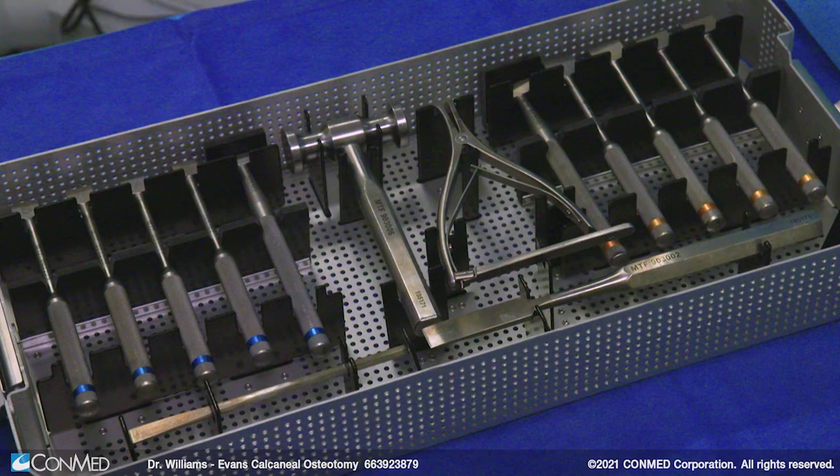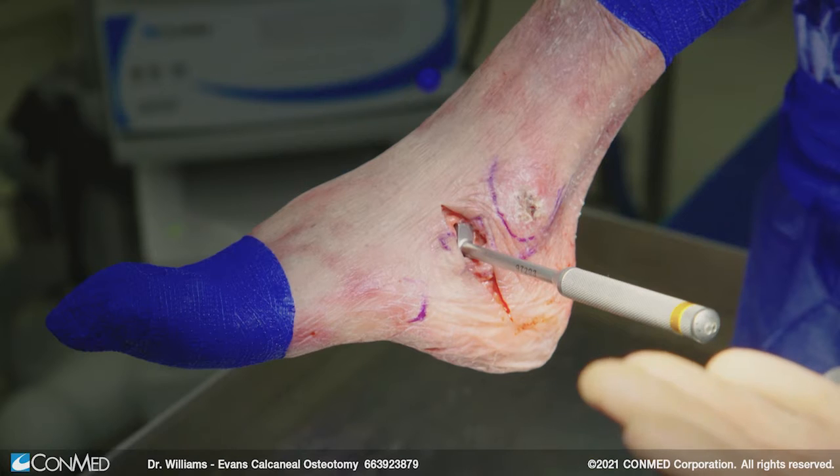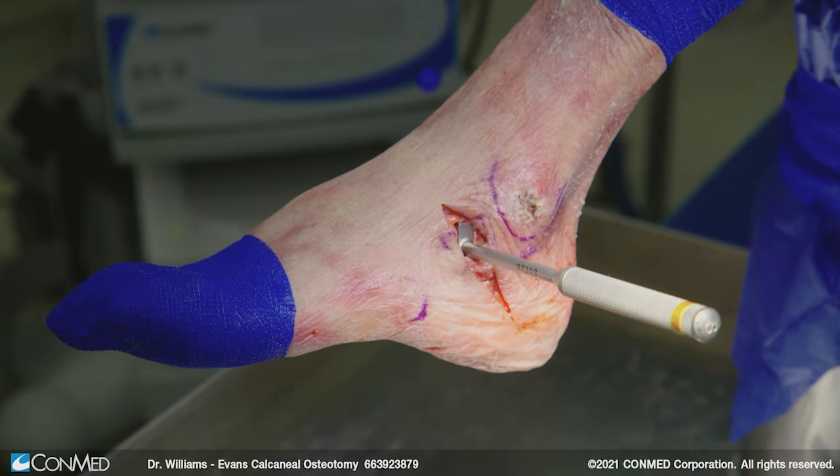Select your size of choice — this is based off of how it clinically looks. Put in your trial sizers; this is an eight. What I'm looking for is to see how that foot lines up. I can use radiographs to look at an AP of the foot and see how the talonavicular coverage is. I can look at the talar bisection and see how that's lined up with the first ray, and also look at the lateral column. When I see the lateral aspect of the calcaneus and the lateral aspect of the cuboid lining up, then I know I have the right size.